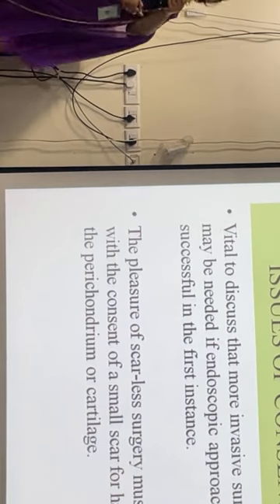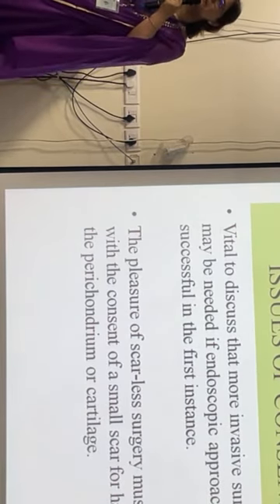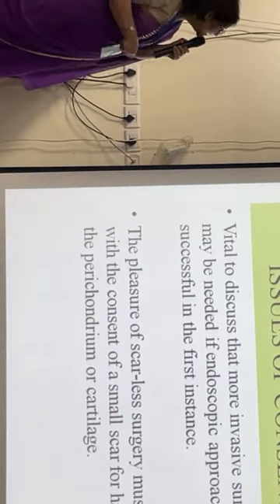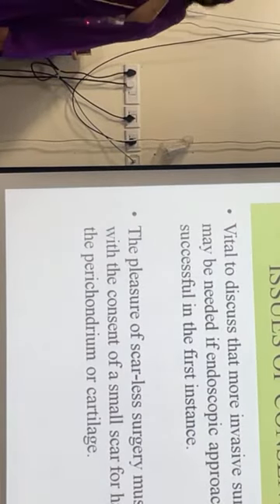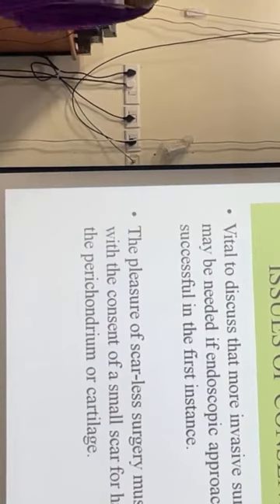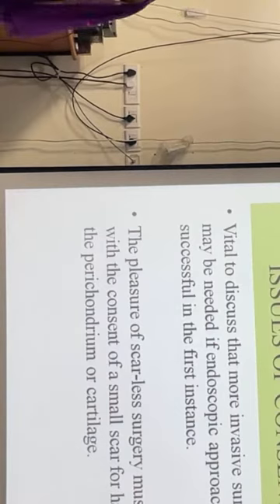Though the patient will opt for endoscopic surgery when we lure him that it will be a scarless, stitchless surgery, we should not forget to take consent that it may have to be converted into a post-auricular approach. And of course there is the small scar, maybe in the region of the tragus, for procuring the perichondrium.